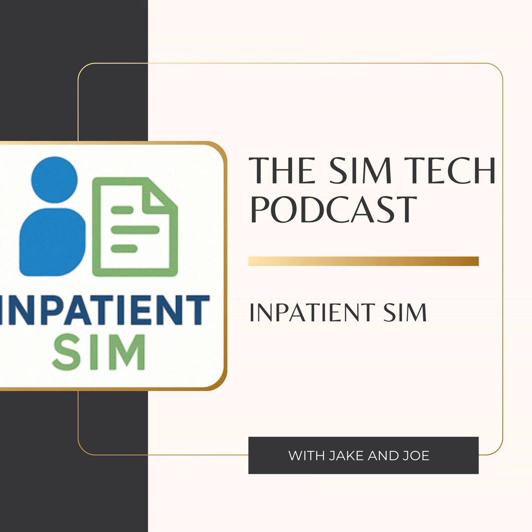Obviously, my name's Jake Rahman. I am the CEO of Simulation Man, who operates as a SimCollective. We are a small healthcare simulation company that are also involved with other companies in development. We don't just sell stuff. We actually are here to try and improve the simulation community and also improve what's available to simulation that's out there. And who have you brought with you?